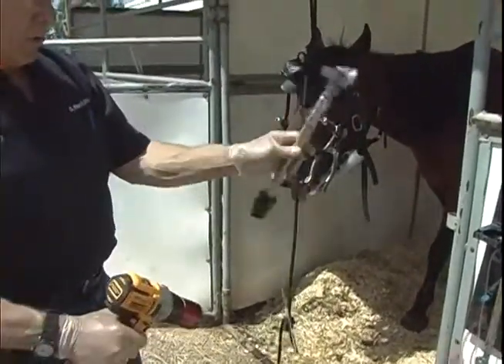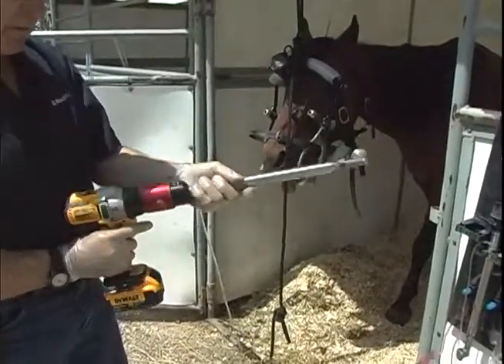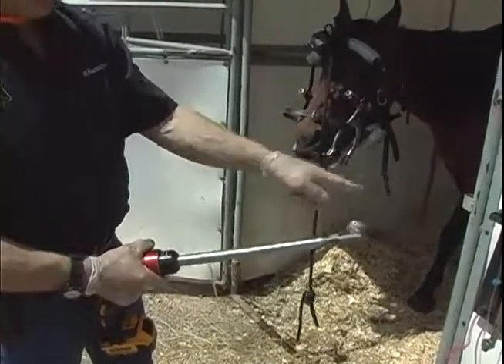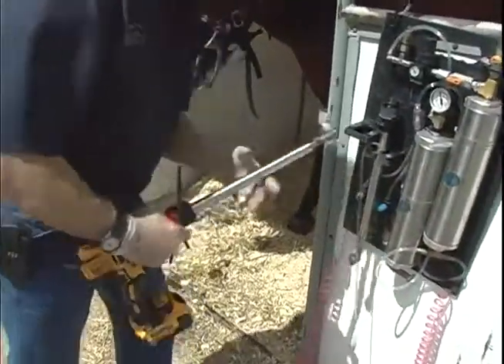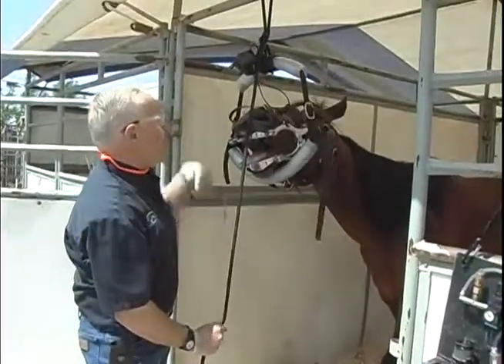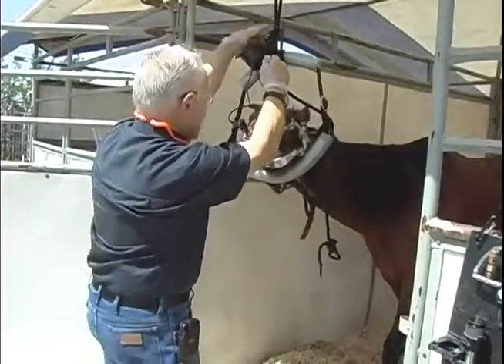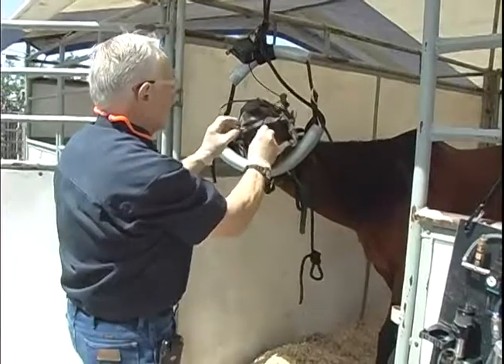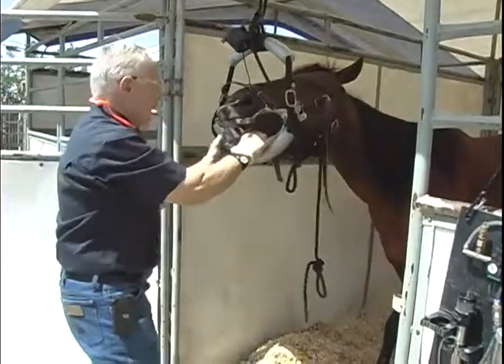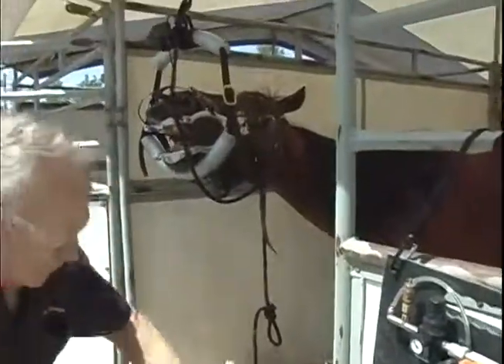Before I lift up the head, I'm currently using a water spray system. The water spray is attached, the nozzle is attached to the PowerFloat. I'm first going to put on the chamfer burr. I'm going to turn on the water spray for this and start to float. So I simply lift up on the chin, pull down on the rope. Horse's head is suspended in front of me at a fairly ideal angle. I'll put the light on. It's difficult to see the light in bright sunlight. And now I'll start to float.